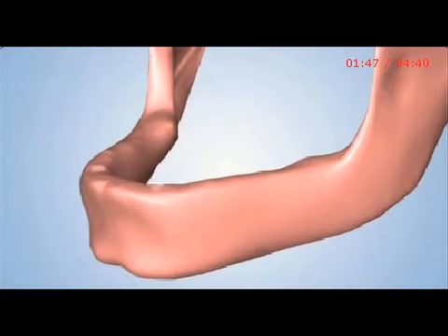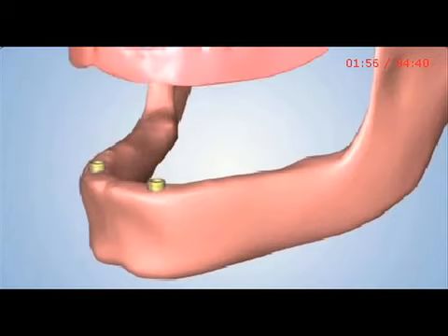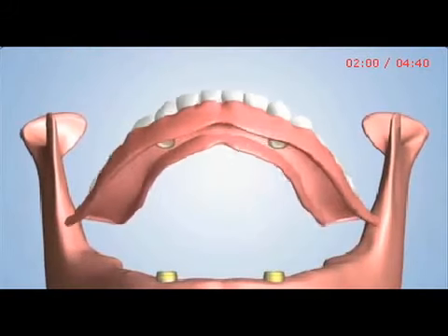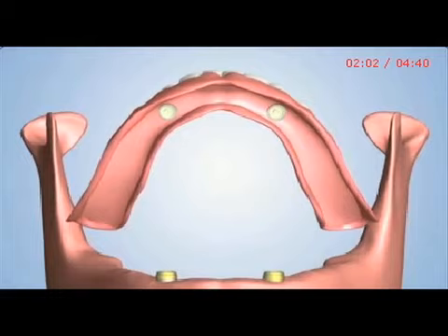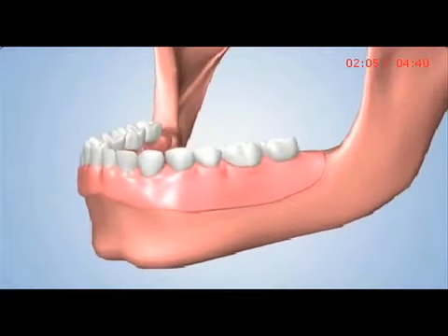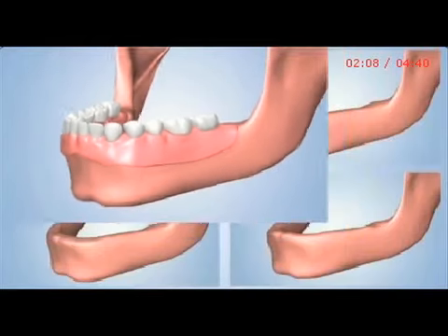One option may involve the placement of two or more dental implants. Special attachments are placed over the implants, making it possible for a customized denture to be secured in place. This is a connection type known as the locator attachment. The denture may be removed by the patient for cleaning.